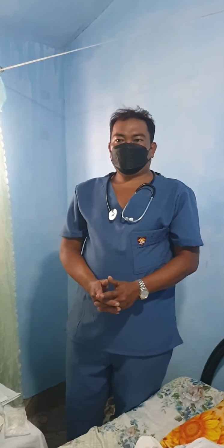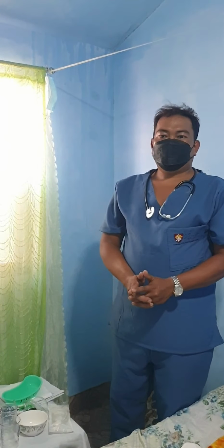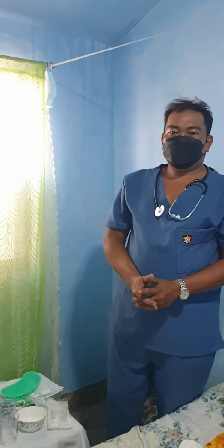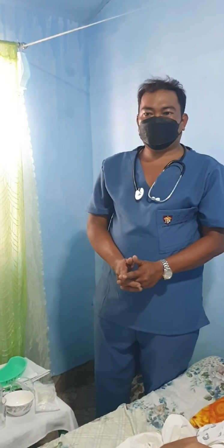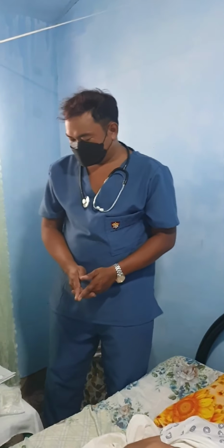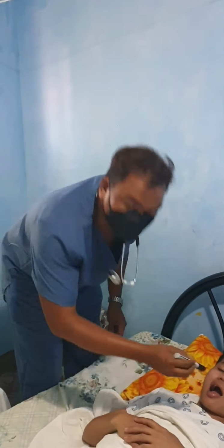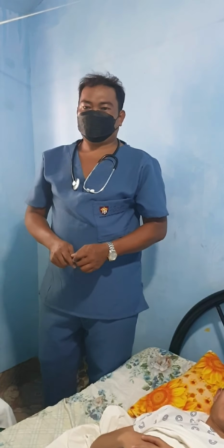Let's start the procedures. First, perform hand hygiene and gather supplies. Visualize, inspect nasal and oral cavities. This is to prevent the transmission of microorganisms and check for signs of infection or skin breakdown.